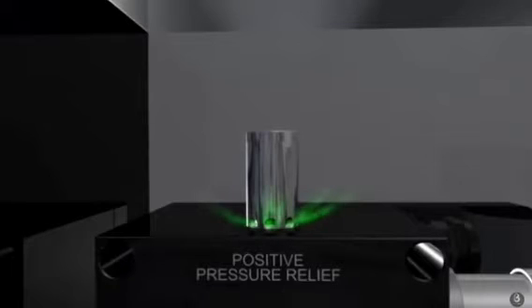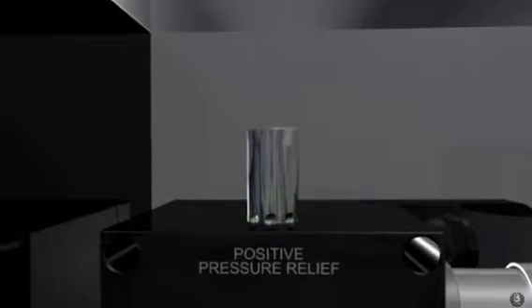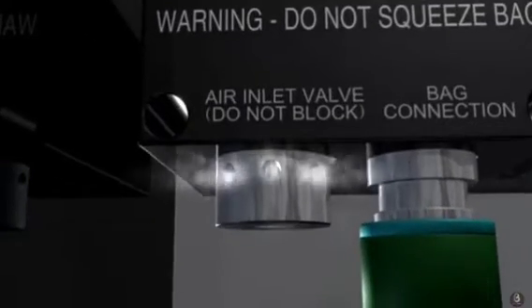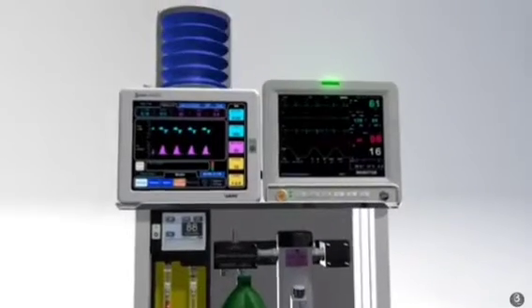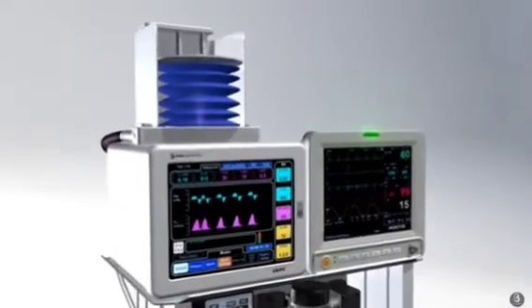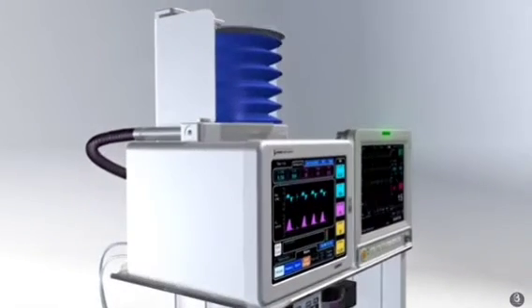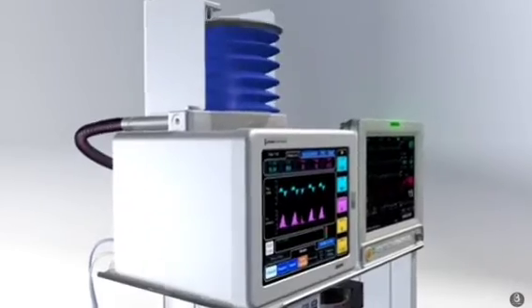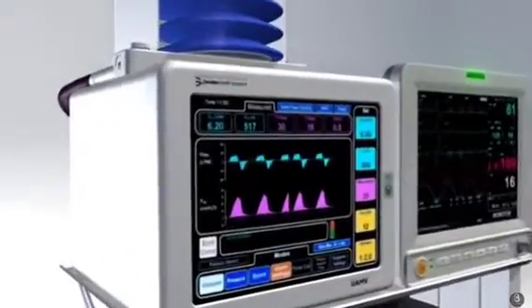Systems for monitoring the gases being administered to and exhaled by the patient, including an oxygen failure warning device. Systems for monitoring the patient's heart rate, ECG, blood pressure, and oxygen saturation may be incorporated, in some cases with additional options for monitoring end-tidal carbon dioxide and temperature.